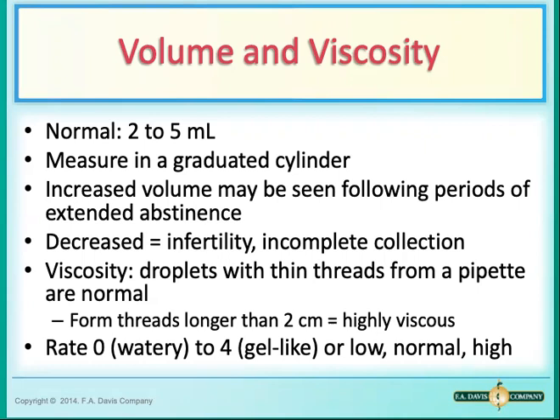Also, we have to make sure that we have a complete specimen when we are evaluating the volume, right? So complete ejaculation. Another parameter that is very important when evaluating a semen sample is the viscosity. The viscosity refers to the consistency of the fluid, and it could be related to specimen liquefaction.